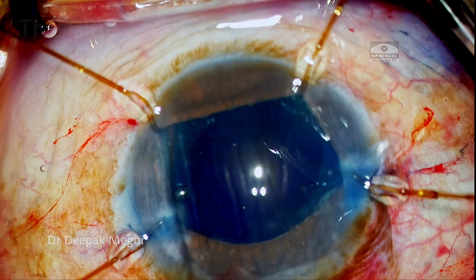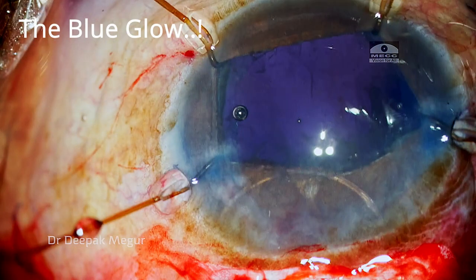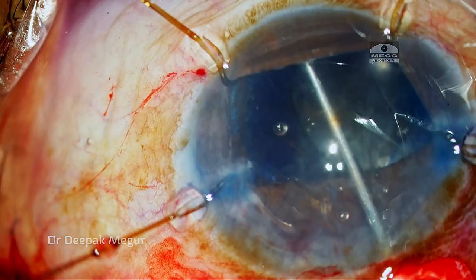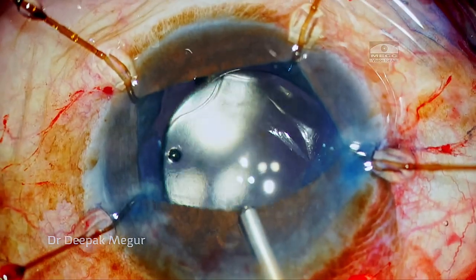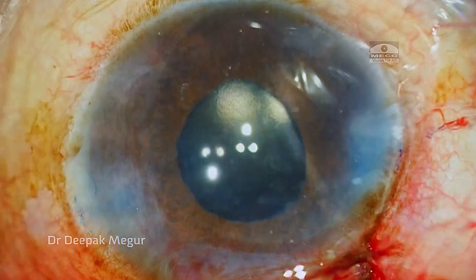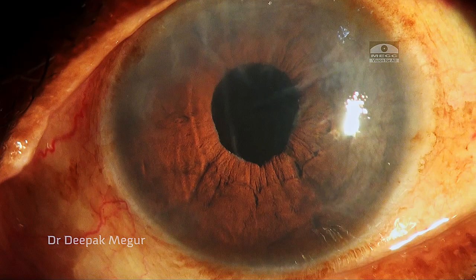After enlarging the rhexis, the nucleus is maneuvered out of the bag and then out of the eye. In the background we have a blue glow instead of the typical orange one — dye has escaped across the compromised zonules into the Berger space. The lens is implanted and vitreous prolapse is ruled out. The moral: surgery could have been much simpler had I used the iris hooks from the beginning.